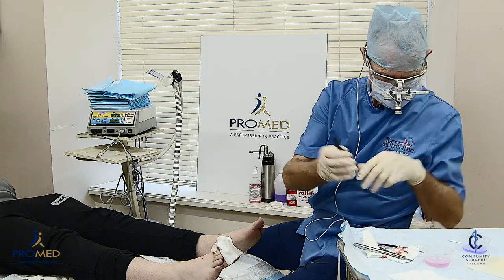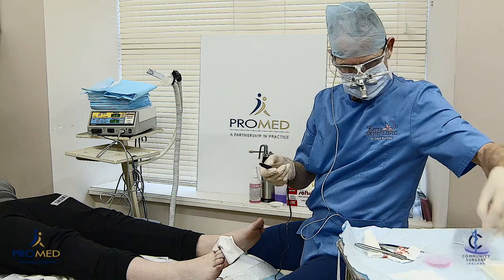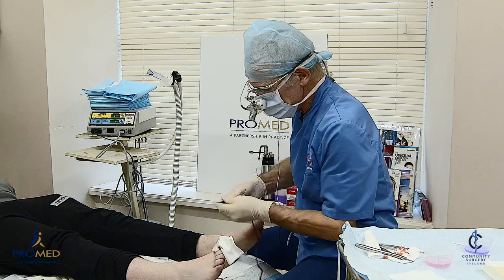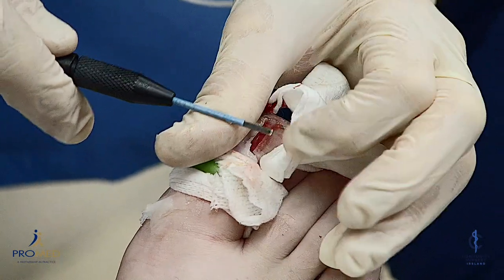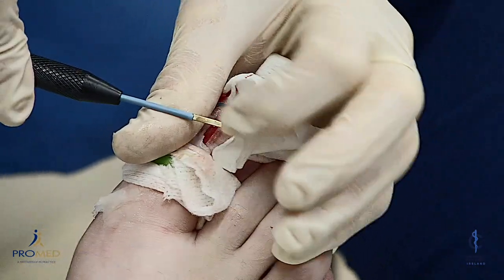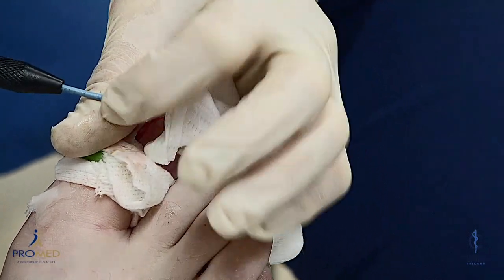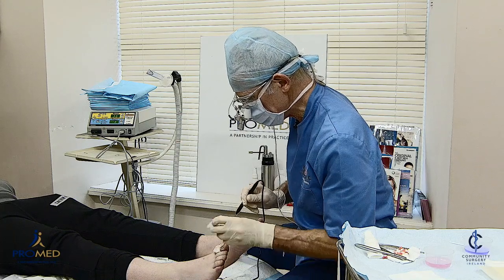This is the radiosurgery unit. There's the tip with a little electrode. This uses radio waves to destroy the nail bed. The electrode is Teflon-coated on one side, which is inactive, and bare on the other side — so everything on the bare side is going to get burnt. We hold it with the burning side down to destroy the nail bed.